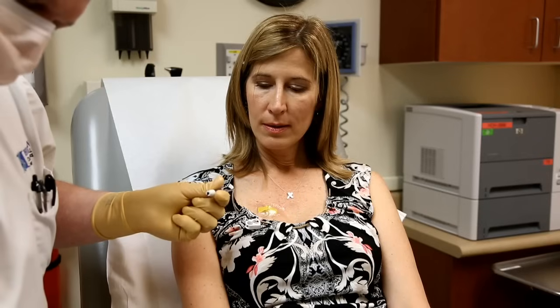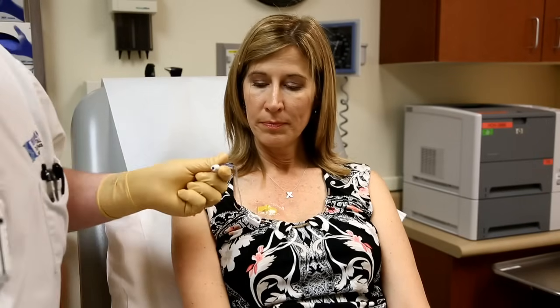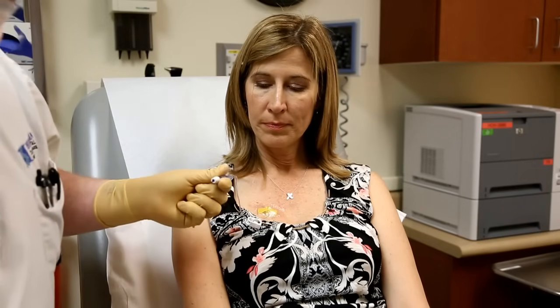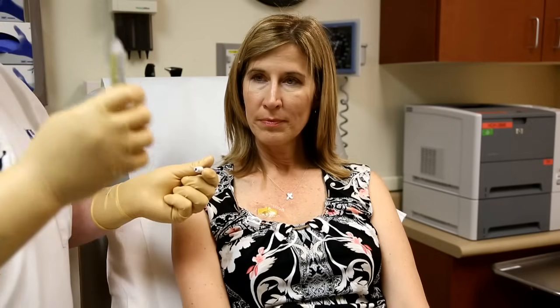I'm just going to flush your line here a couple of times to clear the line and we'll put some heparin in it. And heparin does? Heparin is an anticoagulant, so it keeps the line from getting blocked off since this is in your circulatory system. That way next time we access it we don't have to worry about it being clogged or having any trouble — we can just draw blood or give any kind of medications we need to through it.